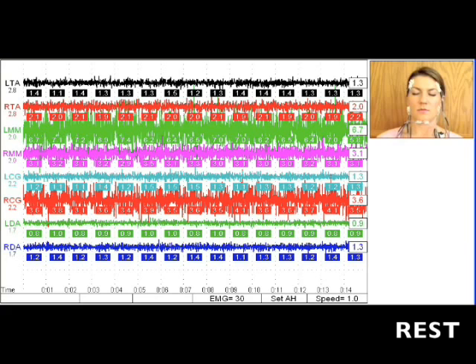When the tracings reach the end of the screen, the program will automatically stop taking data and display the average for each muscle at the far right of the screen.